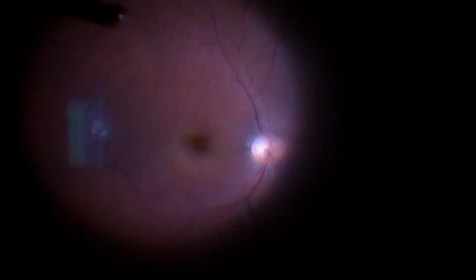Here we can see that once we get a relatively decent view with the BIOM, we have a good view to the retina, and the retina itself is intact. So the nail itself amazingly just went through the lens into the vitreous without hitting the retina or anything else. And you can see we have a really clear view here. So my goal here is just to remove as much vitreous as possible without creating more damage. Plus I want to check the peripheral retina to make sure there's no additional breaks or tears in the retina.